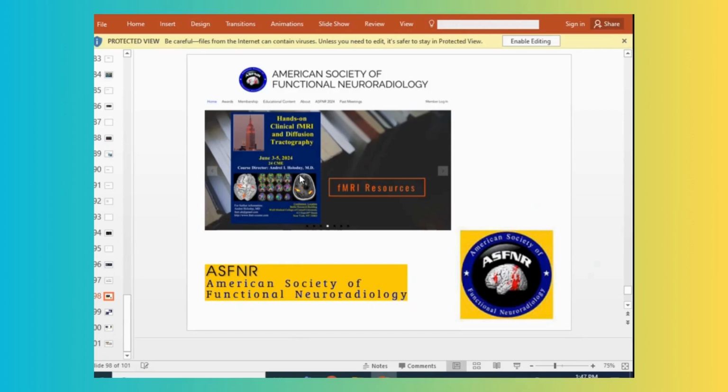So I think this will become part of it. Actually you put it very rightly. At Memorial Sloan Kettering, they are routinely doing resting state fMRI in all patients, because this is a cancer hospital. They are doing it routinely, just like we do DWI. This is part of their protocol, and that was in 2017. So I think they are doing it.